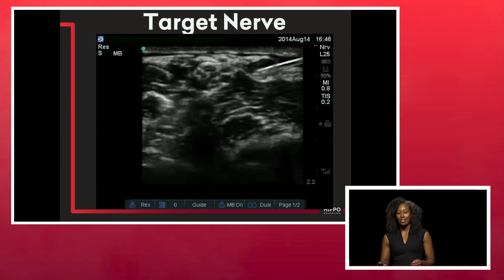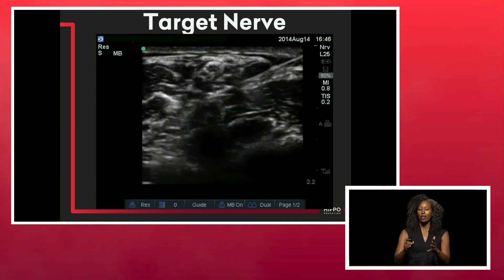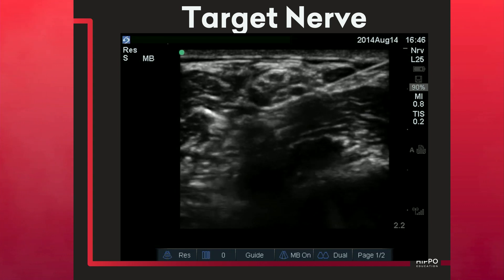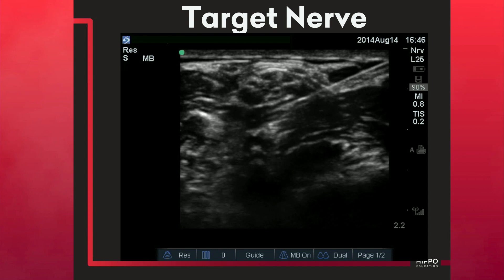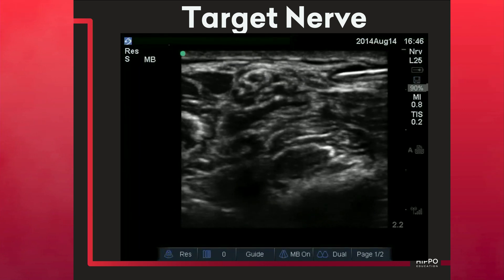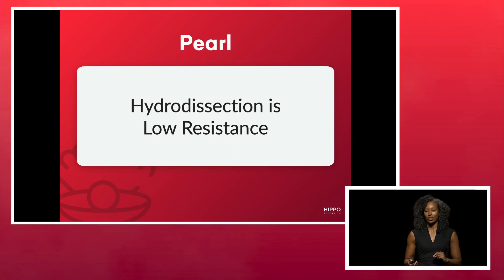When doing a targeted nerve block, initially aim for the posterior portion of the nerve to bathe the entire nerve in anesthetic. Aiming posteriorly first actually lifts your target nerve closer to you, and if there's any air in your needle, that air doesn't obscure your view. Then redirect your needle and go for an anterior approach to deposit the rest of the anesthetic anteriorly.